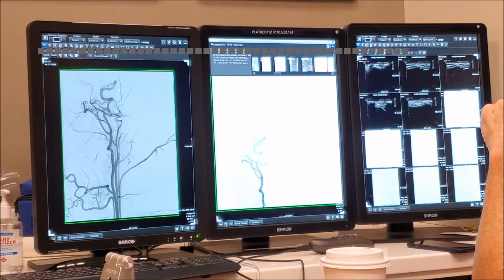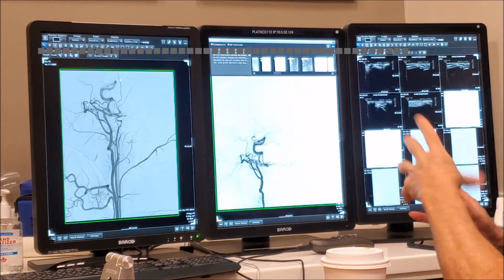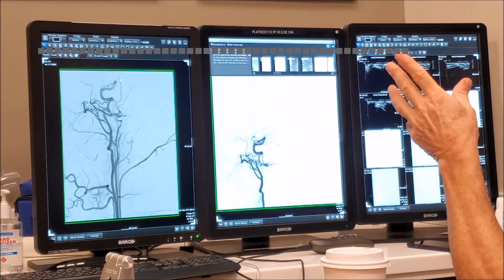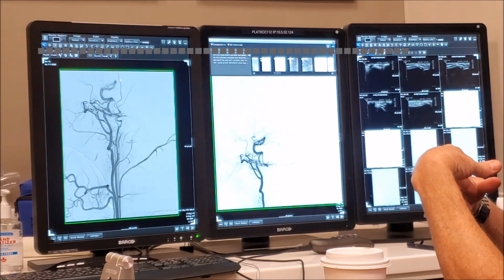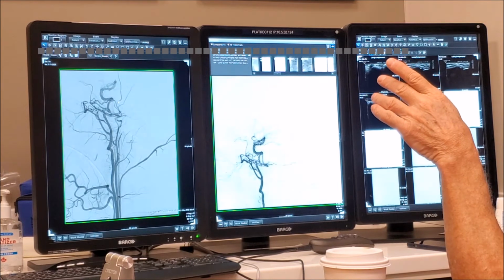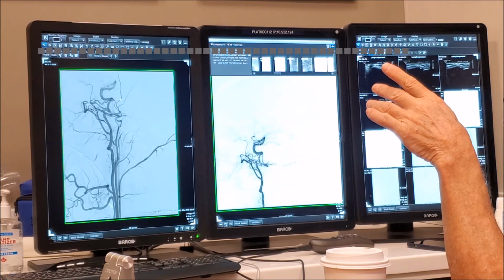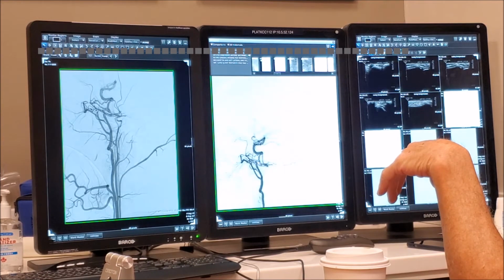Definitely superficial temporal arteries coming over here. You don't see that here, right? There's no superficial temporal. It has a very low origin. What I'm saying is that, again, this is not distorted, it's a variation of anatomy, so we're trying to reconstruct it. We're going backwards. I'm convinced this helped me identify that it was the superficial temporal. This helped me confirm it.